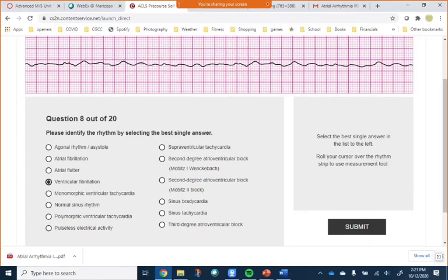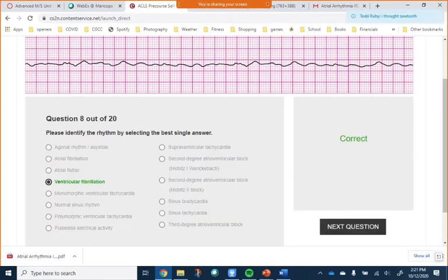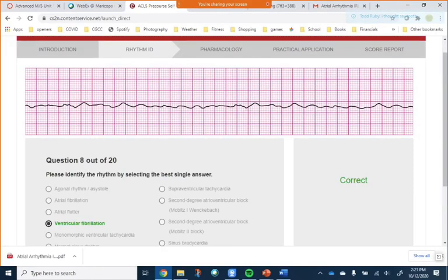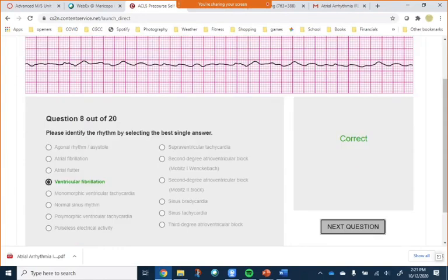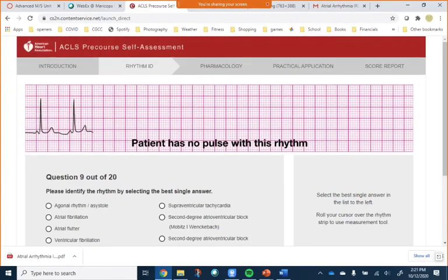And it actually looks like you're not wrong. It could be an AFib. If we had normal narrow QRSs, that would be what atrial fibrillation looks like underneath. But this is basically total fibrillation. And so I'm going to call it V-fib. I wouldn't harm you for calling that agonal rhythm asystole, but they would say there's some organized activity there, and they would want that to be a fibrillation. This one's a giveaway. Don't look harder.